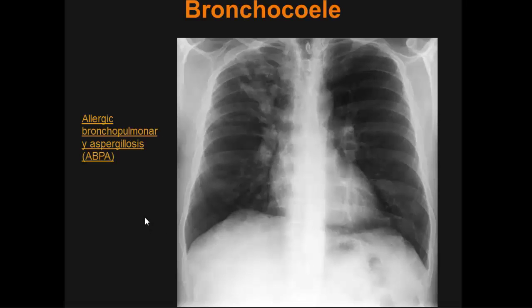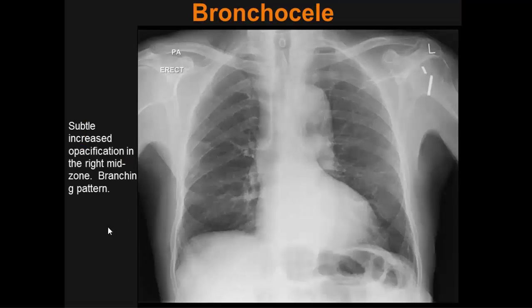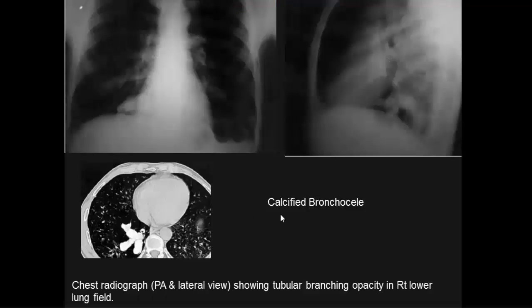Bronchoceles are seen in allergic bronchopulmonary aspergillosis, presenting as mucus-filled bronchi with subtle increased opacification in the right middle zone. Calcified bronchoceles appear on plain radiograph as short tubular branching opacities in the right lower lung field. This curvilinear shadow represents a linear artifact.